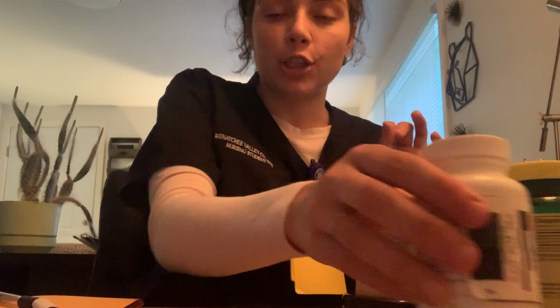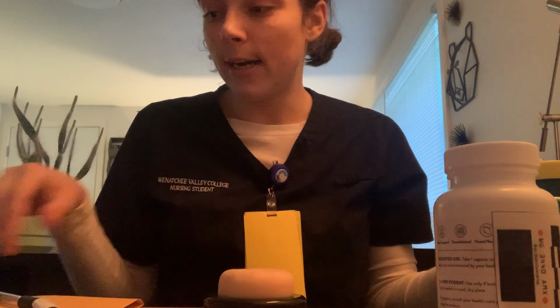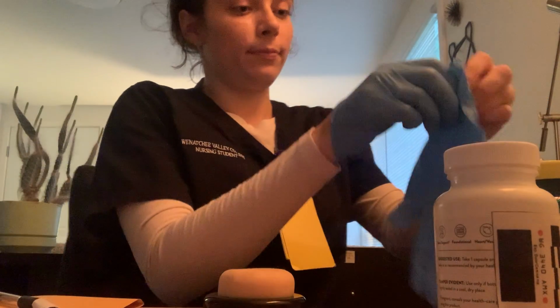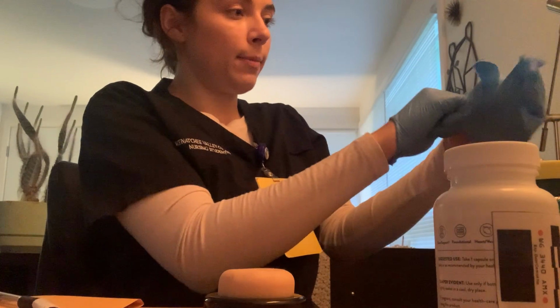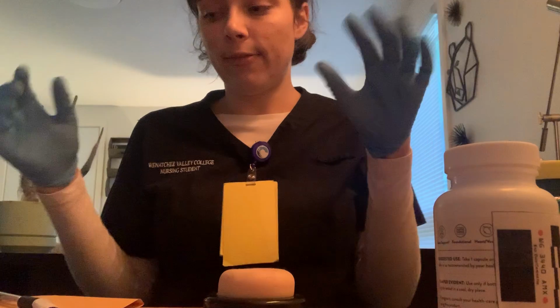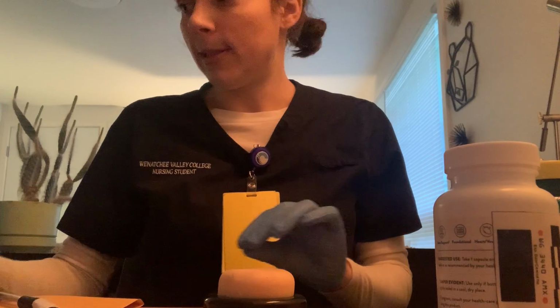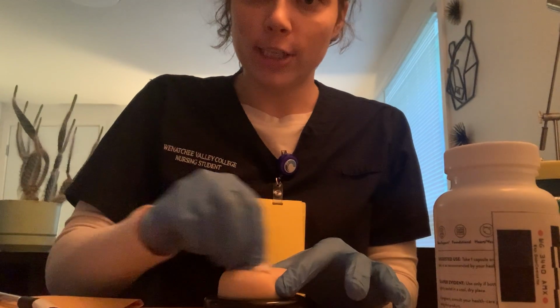Today, my patient has chosen their abdomen to be the site that they will use. It is the best source of absorption. We're assessing for skin integrity. We're making sure that we're rotating our sites. Applying gloves here. We're going to inject at a 45 to 60 degree angle for our smaller patients and a 90 degree for our larger patients. She is going to be a 90 degree angle today. We will take a fresh alcohol swab that I do not have, vigorously scrub.